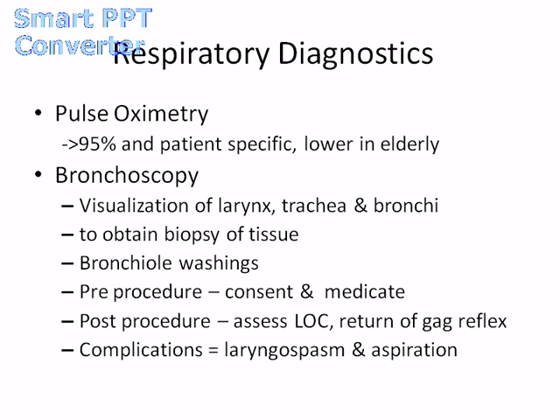If they're hypothermic, you'll get a low reading. They have poor peripheral blood flow. Their hemoglobin level is low. You might get a low reading. If they're moving around, they have any edema, or if they have dark nail polish on, because the beam can't go through their nail. So you can also use an earlobe or a nose or a toe as well. I'm not going to go through how to do that because you guys all know how to do that.